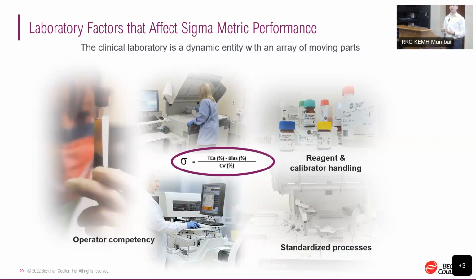Then operator competency is very important again. So the operator is the one who is driving all these things. Like Seth was talking yesterday, that I would love to audit a technician rather than the consultant, because those are the people who are performing those assays and they know each and everything in and out of the instruments on which we are getting these analytes done. So competency to perform calibrations, competency to perform the maintenances, competency to perform the dilutions, all that matters.